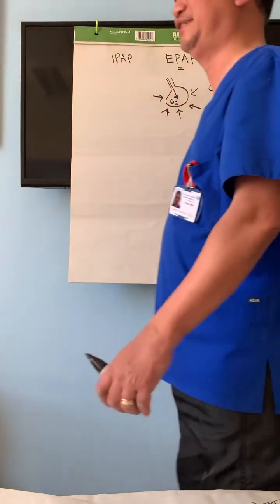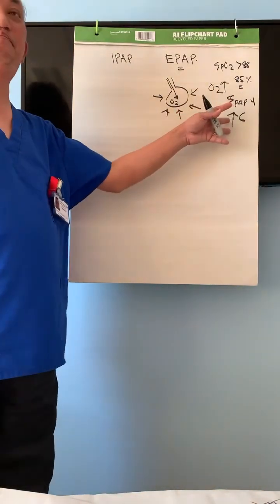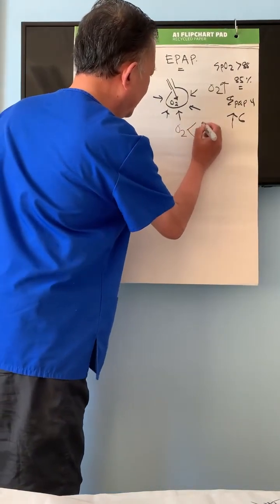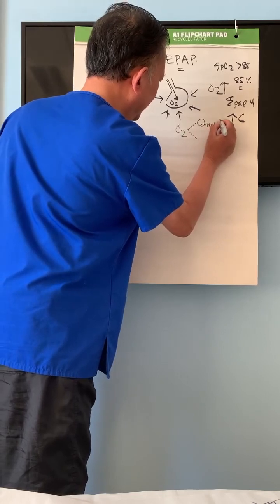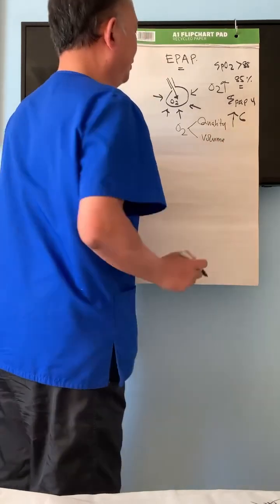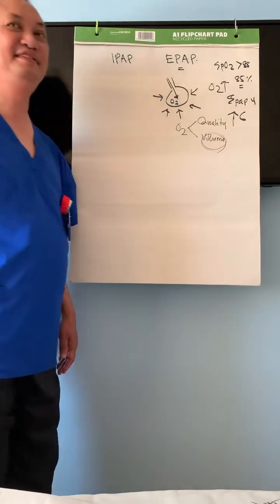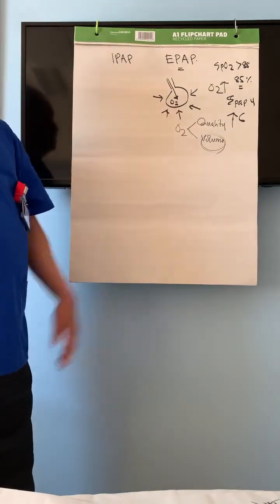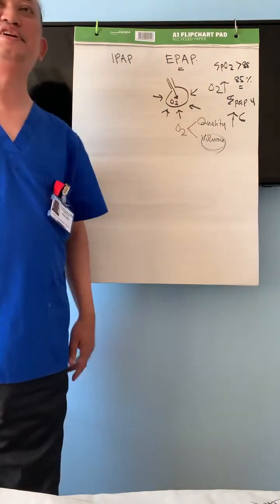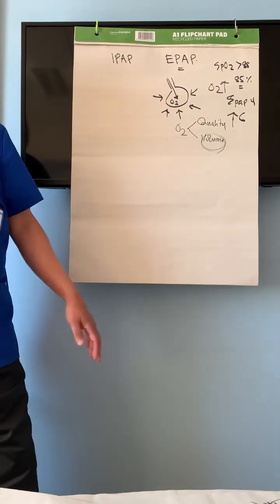This is how we adjust the oxygen, and not only by increasing the pressure. Actually, as I have said, regarding the oxygen, there are two: quality and volume. The pressure is the volume. Actually, you are adjusting the volume. Always try to think of the quality first, because volume or the pressure can make the injury. Quality will not make the injury.